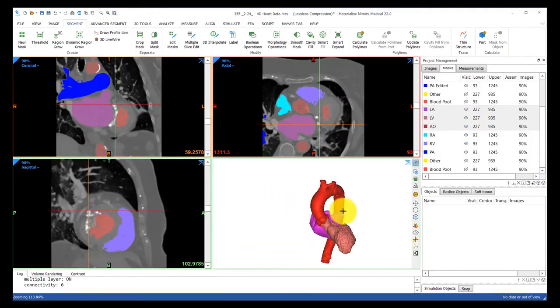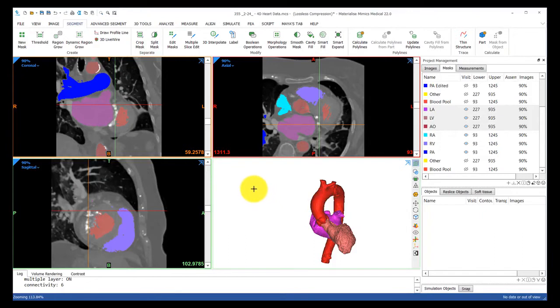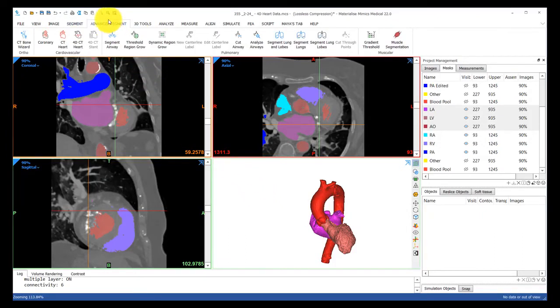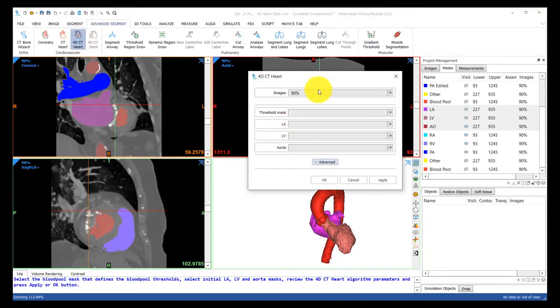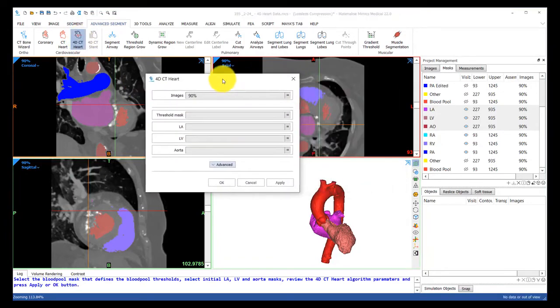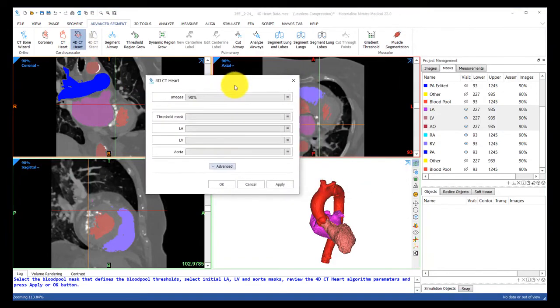Now we're ready to propagate these edits to the rest of the cardiac cycle. So let's head back over to the advanced segment tab where we'll use the 4D CT heart tool this time.